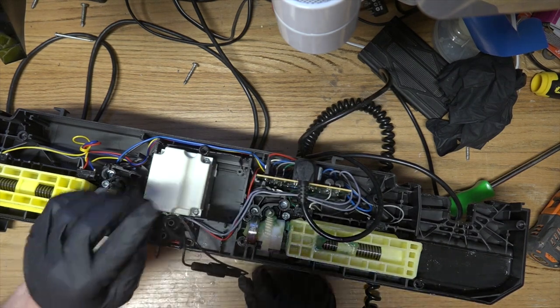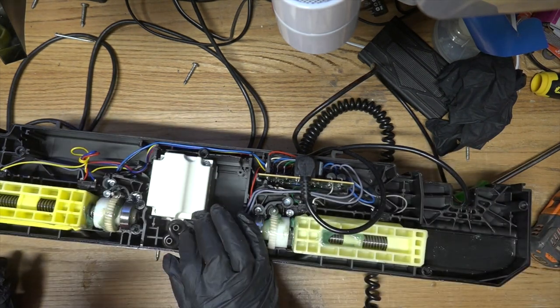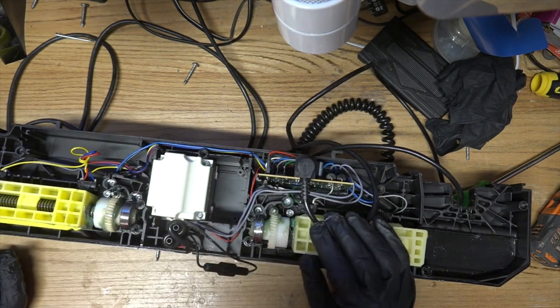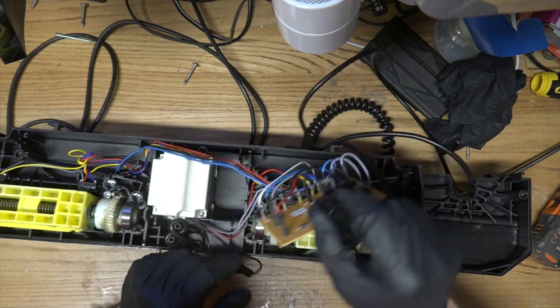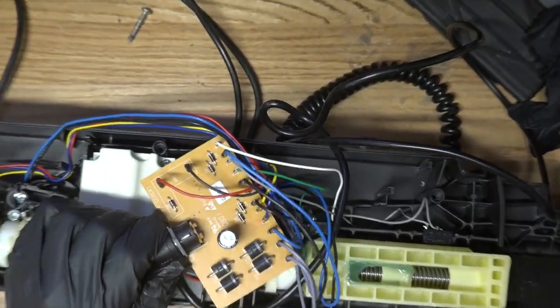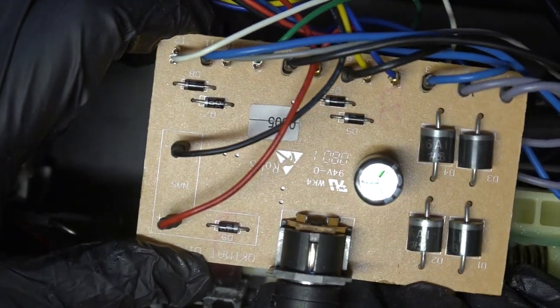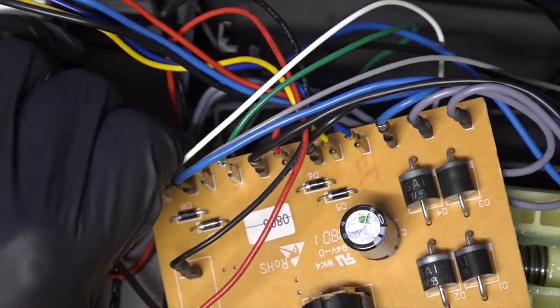Anyway, so there's that. Let's take a look in here. Oh, that's a transformer. So line voltage is coming in here and going into that transformer, and then probably going to the circuit board here to be rectified. Let's take a look at that guy. Oh yeah, bridge rectifier. There we go. A little bit of filtering. Doesn't need much. It's all analog. There's no digital here. And this guy just controls who gets the current. Those are some hefty diodes on there.